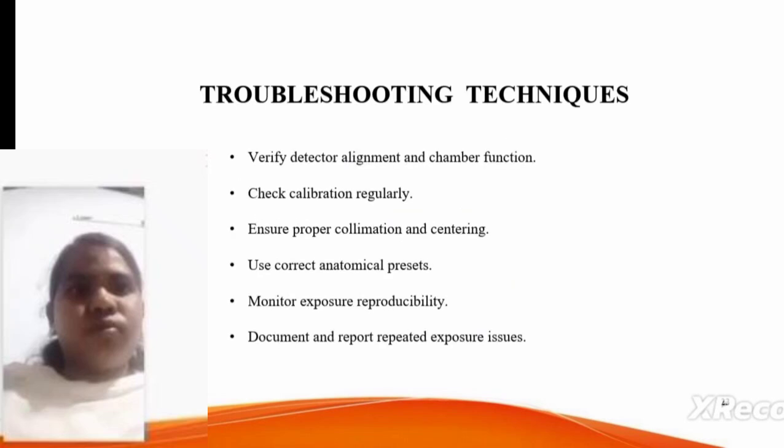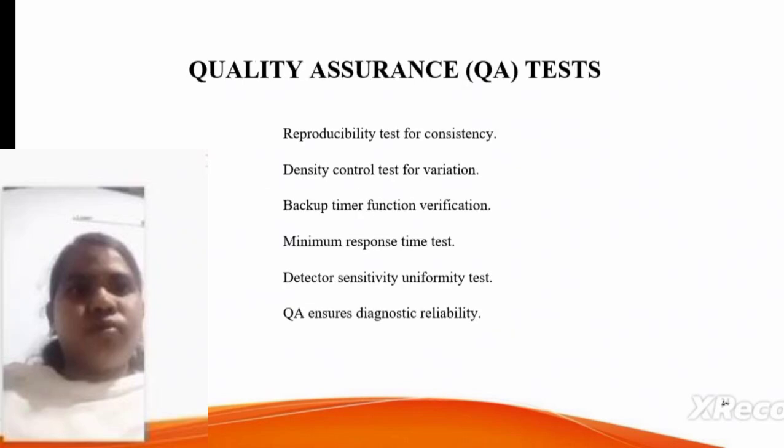Troubleshooting techniques: verify detector alignment and chamber function, check calibration regularly, ensure proper collimation and centering, and use correct anatomical presets.